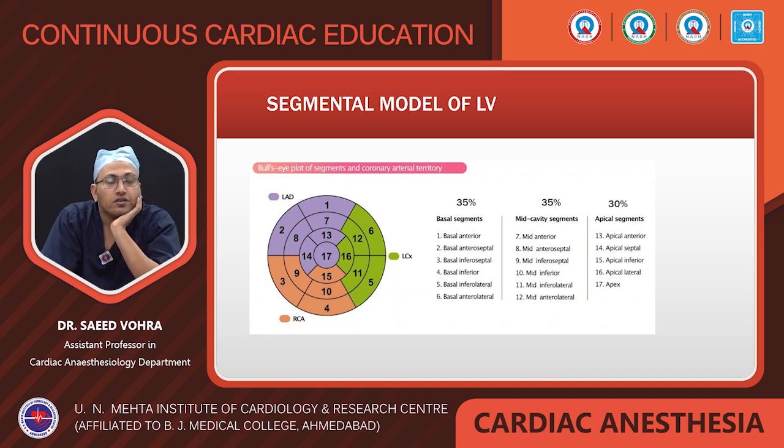Starting from the outer part, it is basal anterior. Then there is a basal anterolateral going clockwise, and then there is a basal inferolateral. Then there is a basal inferior, and basal inferoseptal, and basal anteroseptal.